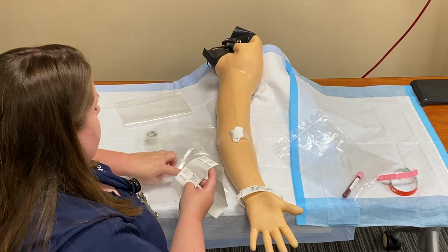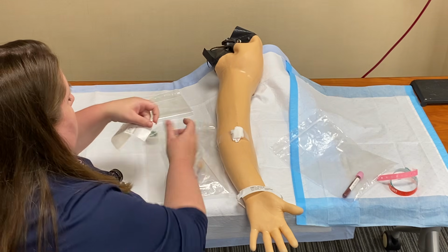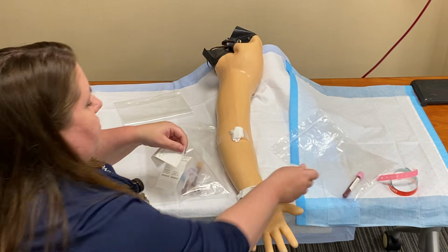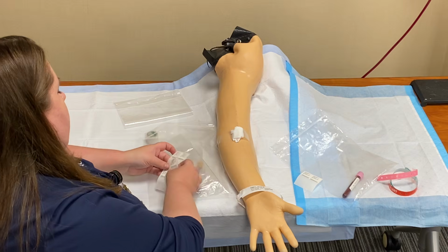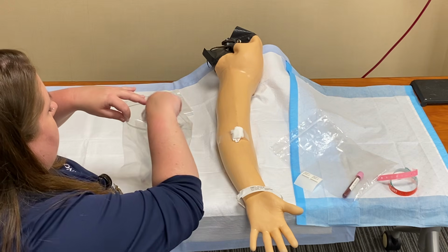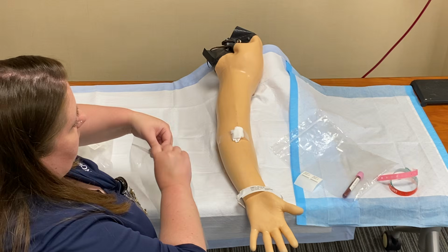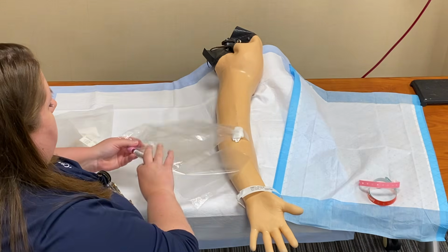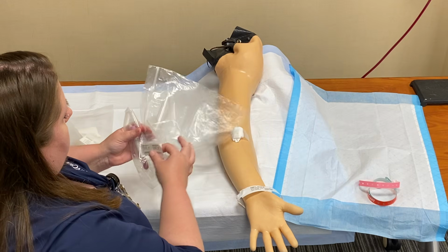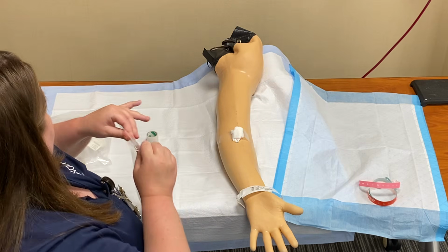So I'm doing my PT, CBC, and BMP in here. So I have my PT, my CBC. This is my type in screen label. And then this is my CMP label. So I'm going to put those in that bag. Put my pink sample in the second bag with the pink label, and I'm ready to send these.